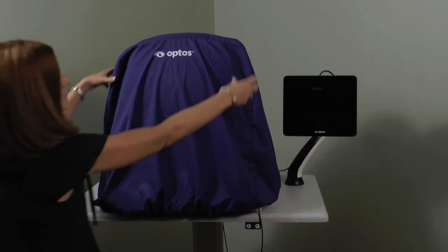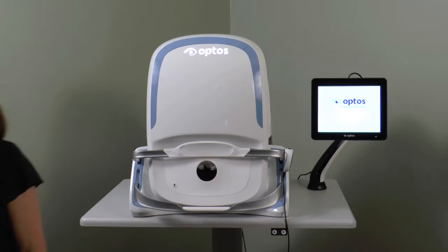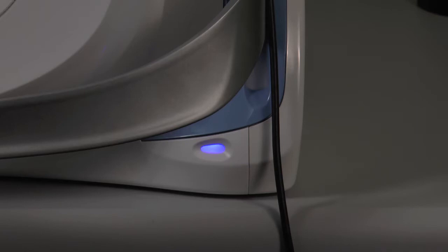At the beginning of each day, remove the dust cover. If the device has been turned off, locate the on-off rocker switch on the back and switch to the on position. If the device was put into sleep mode, simply touch the blue indicator light to activate for capture.